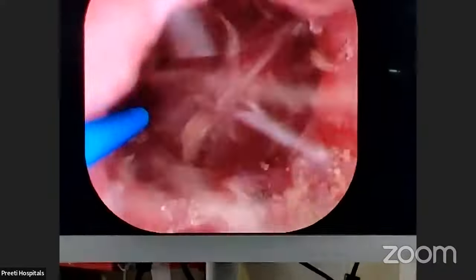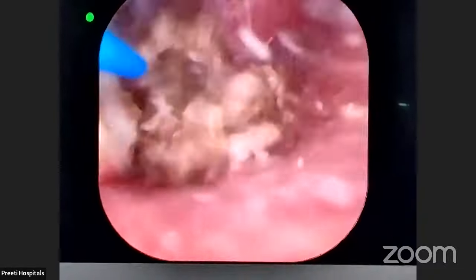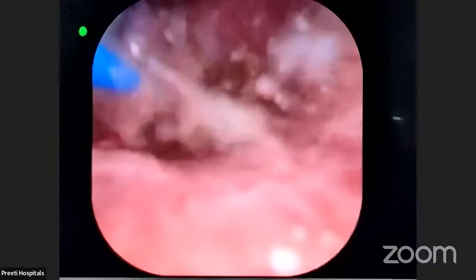See, now we can take out the fiber. Ramakrishna is telling that you keep it with the weight, don't flush. I will do some more time and take out the fiber so that water will flow better and suction will happen better. I will do another 2 minutes.